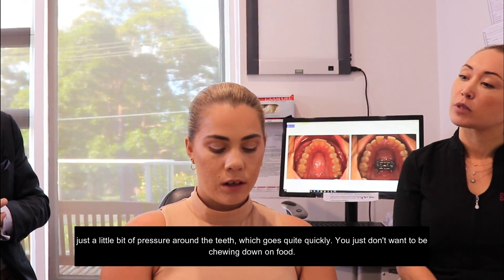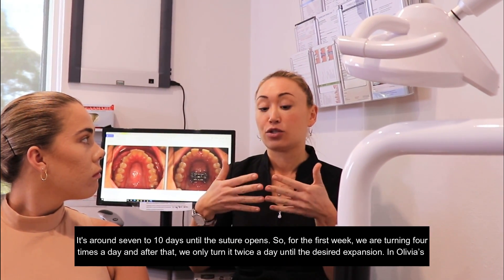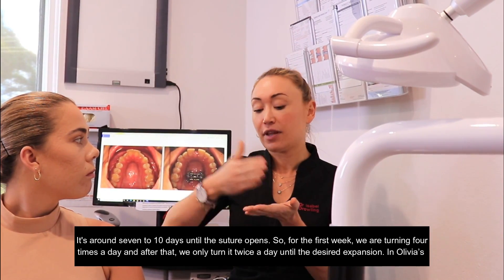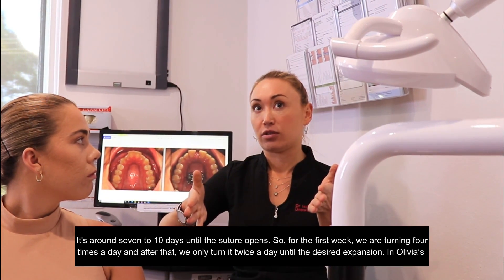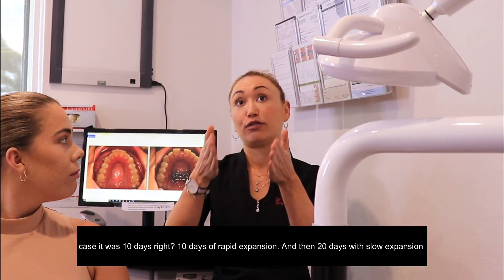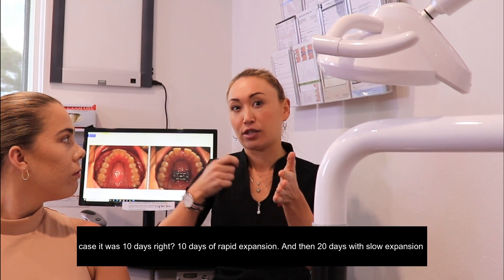You just don't want to be chewing down on food. Basically it's around seven to ten days until the suture opens. For the first week we are turning four times a day, and after that we're only turning twice a day until the desired expansion. In Olivia's case, it was ten days — ten days of rapid expansion and then twenty days of slow expansion.